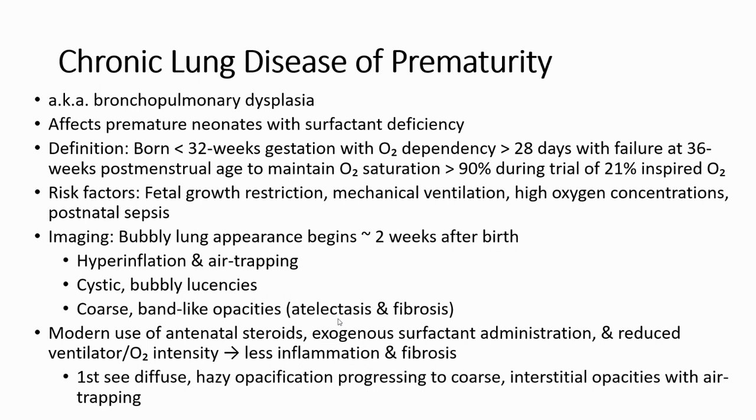In the image, what we have to find is a bubbly lung appearance beginning around 2 weeks after birth, with hyperinflation and air trapping, cystic and bubbly lucency, coarse band-like opacity, with consolidation, atelectasis and fibrosis.